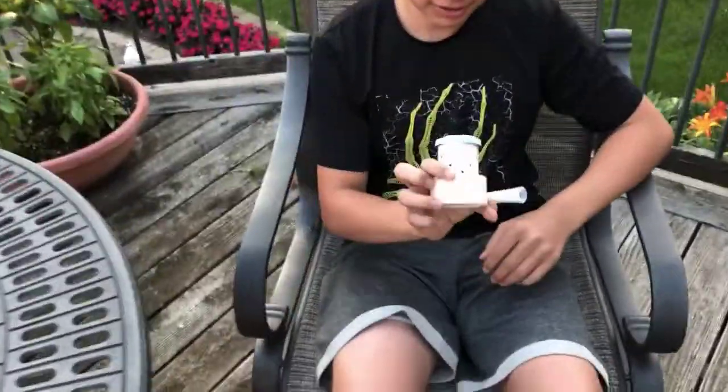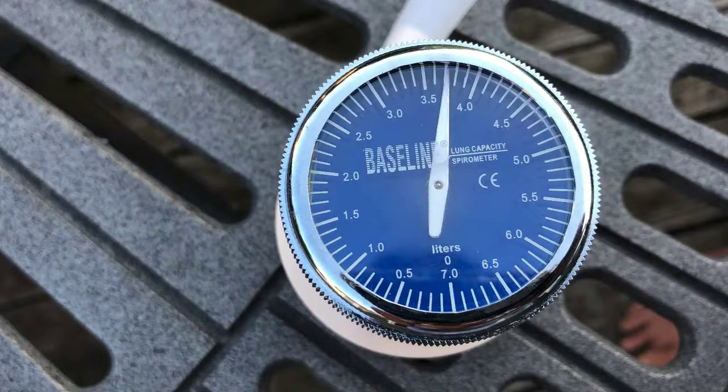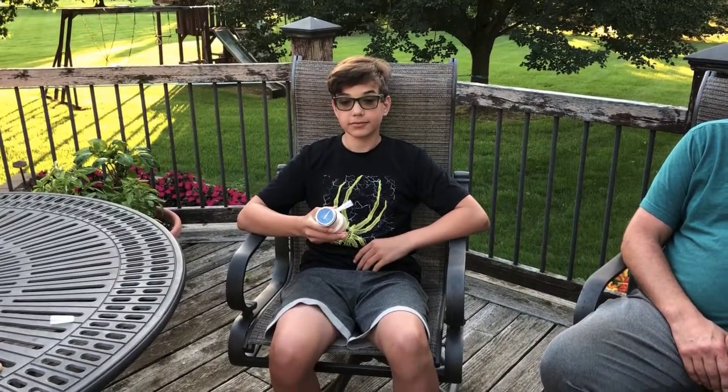All right, let's see if that number is bigger. Yeah, way bigger. Look at that. So 3.7 liters. Okay, go ahead, reset. We'll do trial number two. Trial number two, vital capacity, whenever you're ready.